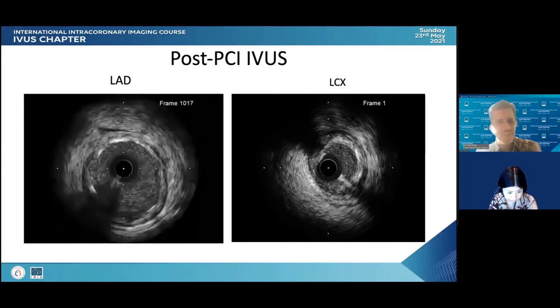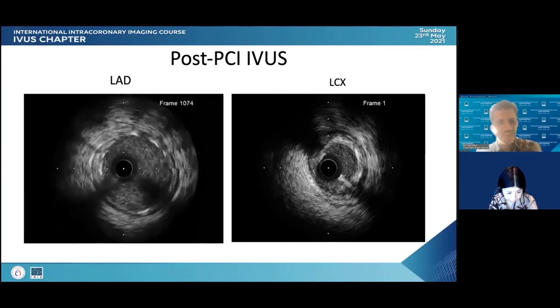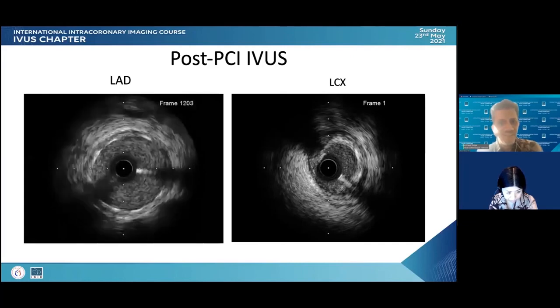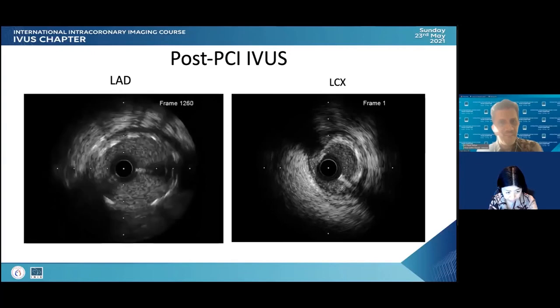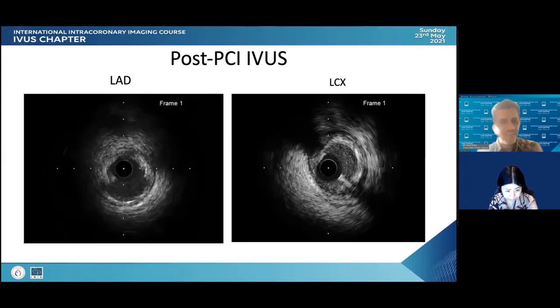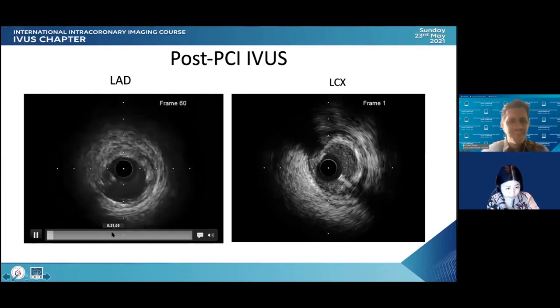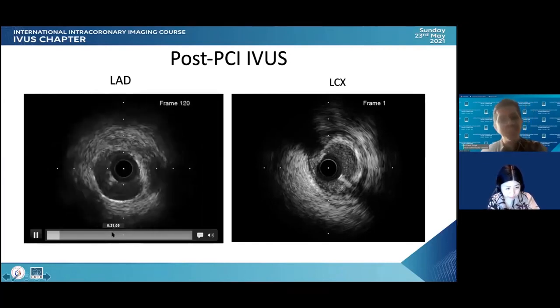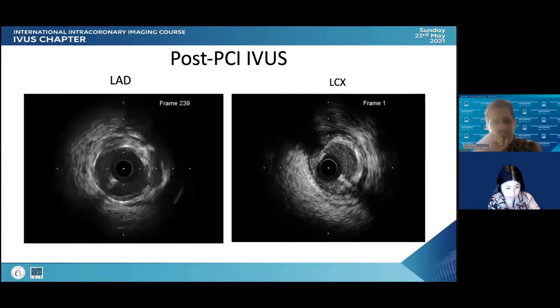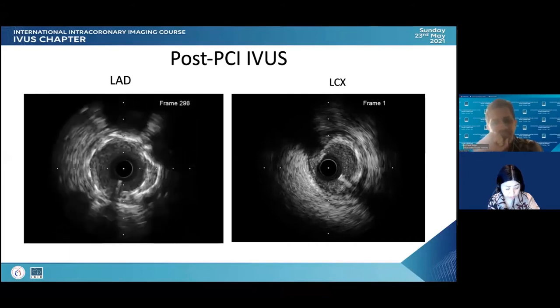And this is the left main. And the left main, well, expanded. And then I check the edge of the stent. And we remember the proximal segment was okay. Actually, that's protruding to the, yeah. So based on this picture, I think the overall LAD really looks good. And the left main is also good. That's it.